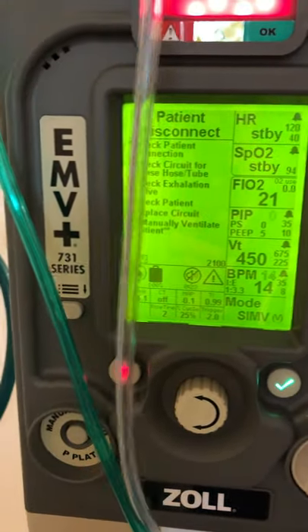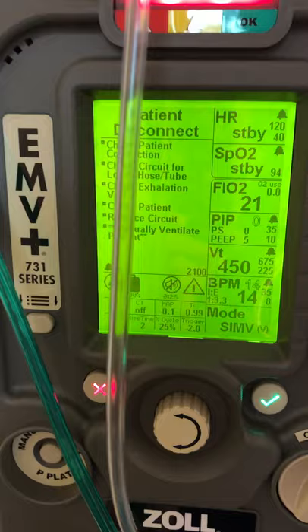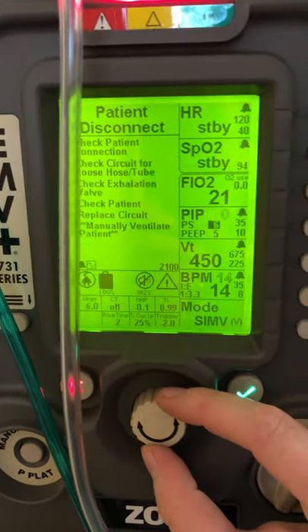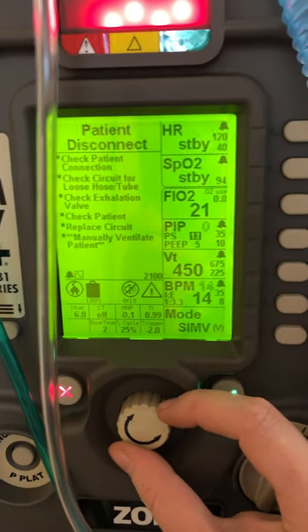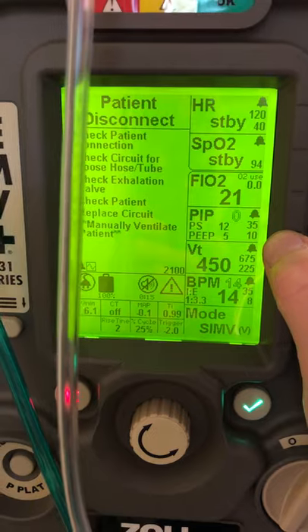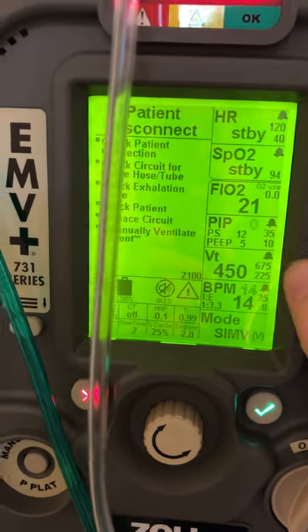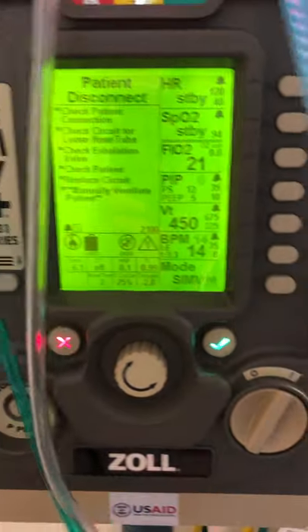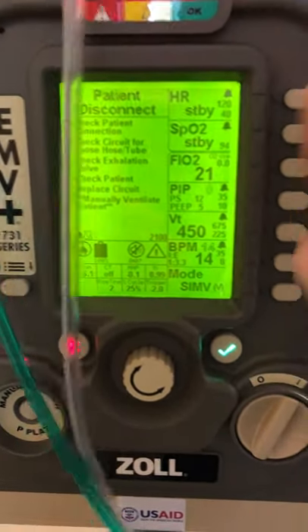Coming up here, you can see it defaults to a pressure support of 0 — we don't want that. Let's change that by arrowing it up. Let's go to 12. Green check mark. PEEP of 5 — I'm okay with that. High pressure 35 — that's okay. FiO2 right now is 21. If I wanted to change that, I need to make sure I'm plugged into oxygen, but I could increase it.